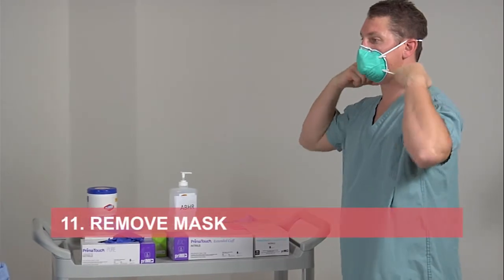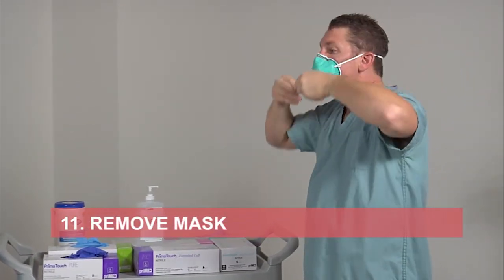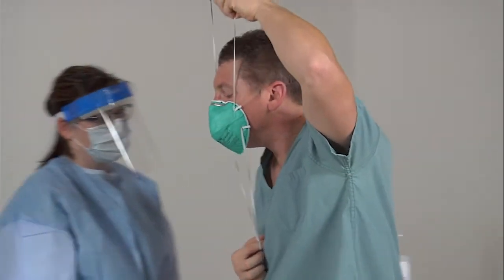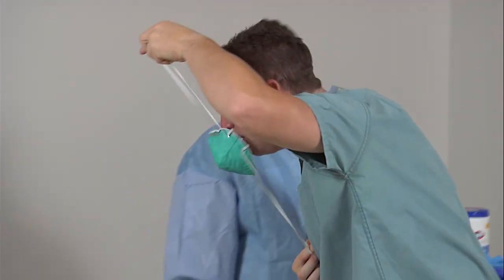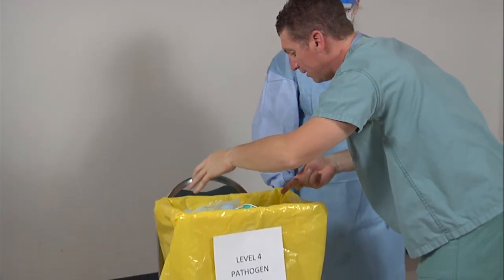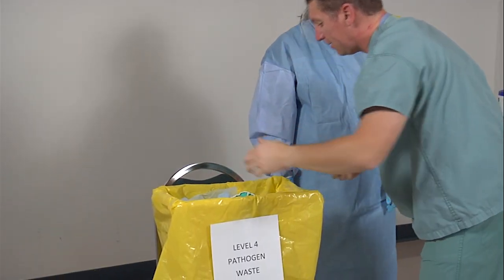Remove your N95 respirator by lifting the bottom elastic over your head first, then the top elastic up and over. Lean forward and pull the respirator forward off your head, allowing the mask to fall away from your face. Dispose of the respirator in the waste bin.